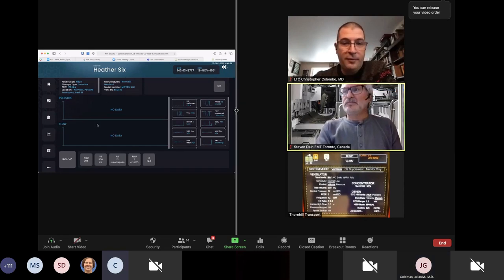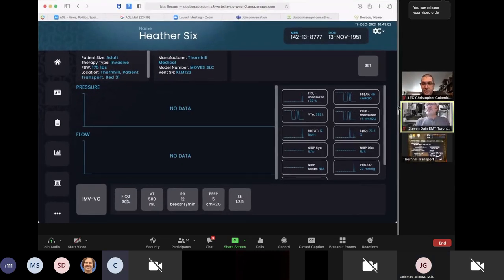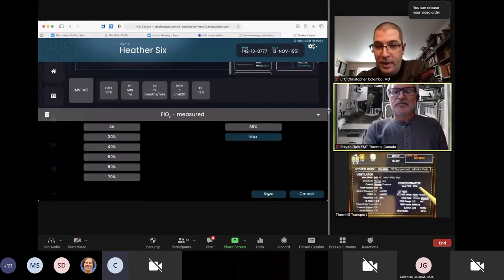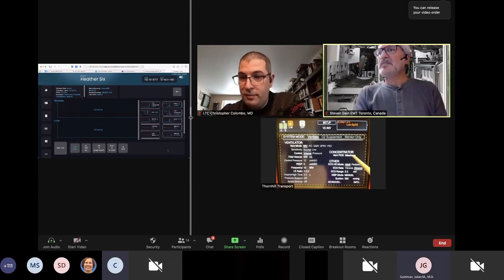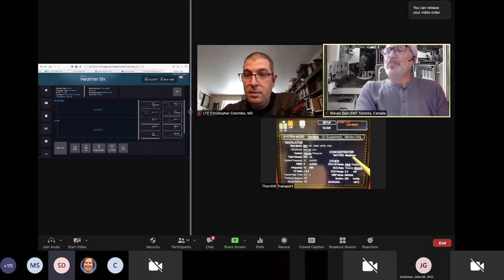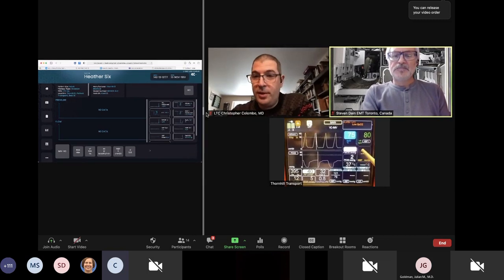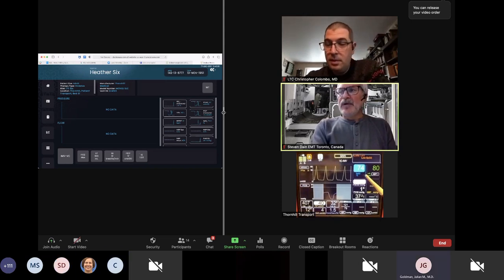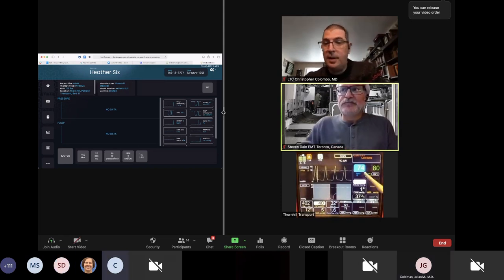And I can see that the FiO2 is at 30%. I'm going to go ahead and increase that to max for you. If you can just verify that that's occurred. Yeah, I can see that on the screen there, and I've got it on the pointer. Okay, so that may take a minute, but we'll just watch those stats with you. Thank you for putting the camera back on the vent. I see 75%. We may have to readjust that probe. Is it in a good place? Yep. Okay, good. So if that's reading accurately, that's not responding fast enough.